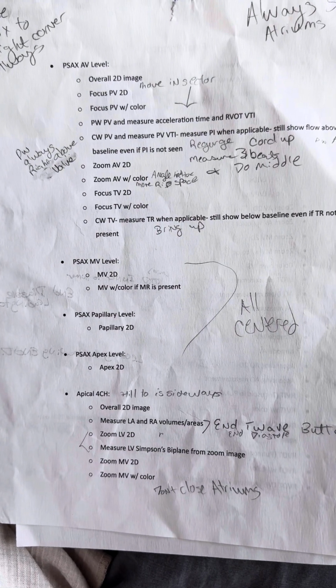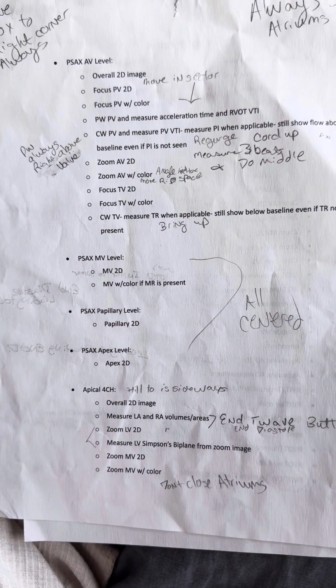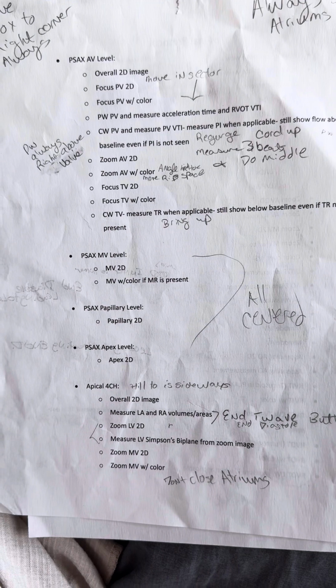Then zoom your left ventricle. Measure left ventricle Simpson's biplane.